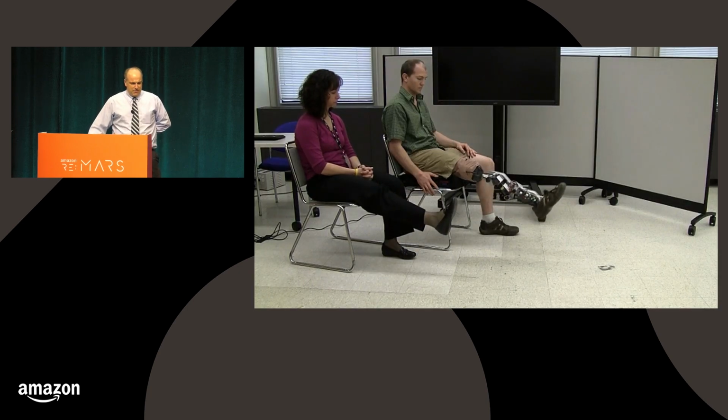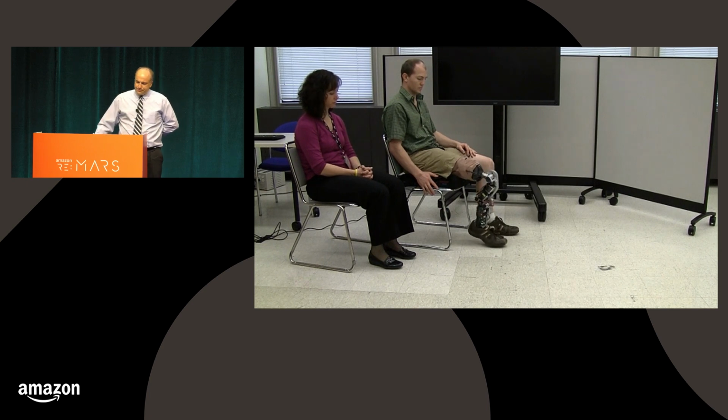So this is an example. The guy's name is Zach Votter. He's had a surgical intervention to restore some ankle control information. But generally, we're using the same tried and true algorithms that we had developed for controlling arms to control the knee and ankle. So he's able to mimic the movements of the therapist.